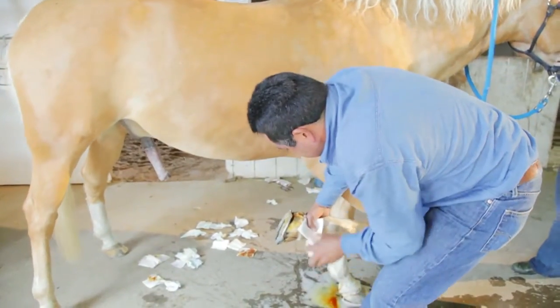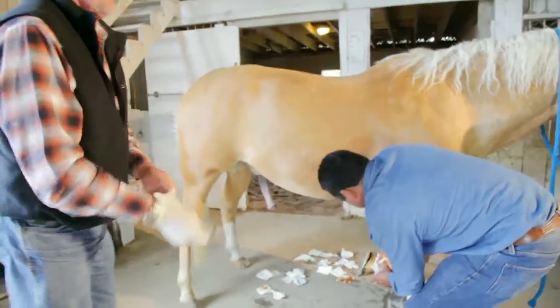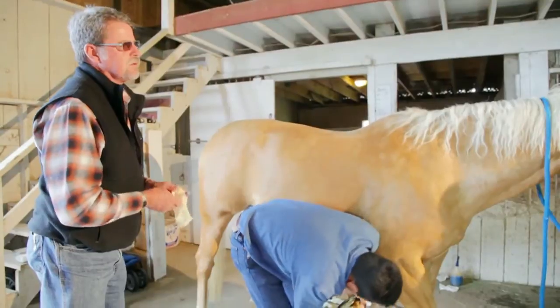That tells us a number of things. One, we're absolutely in the right spot in the pastern joint. And two, there is osteoarthritis happening because we have serosanguinous joint fluid. That is diagnostic in itself, too.